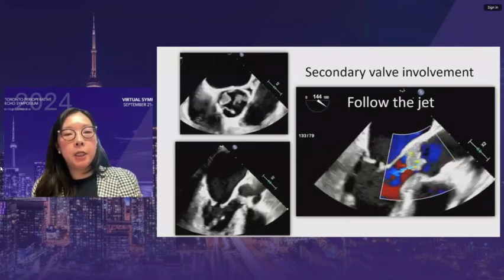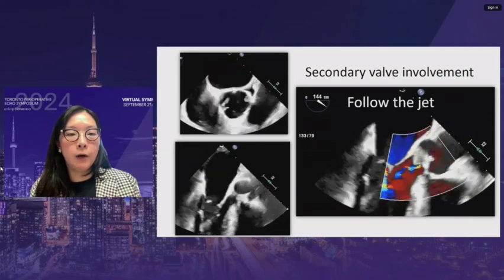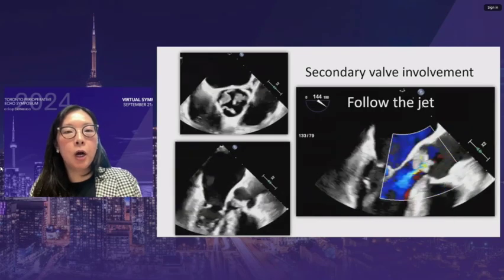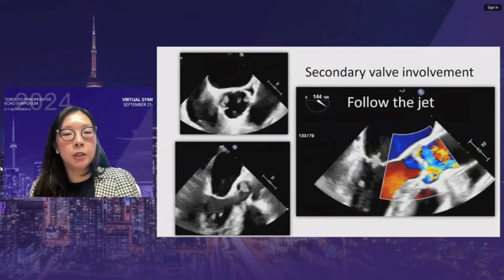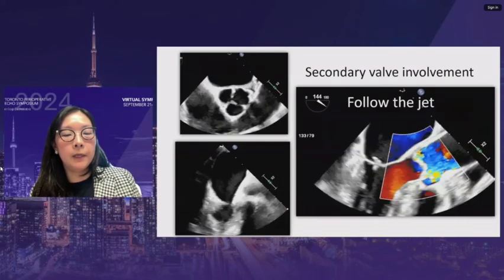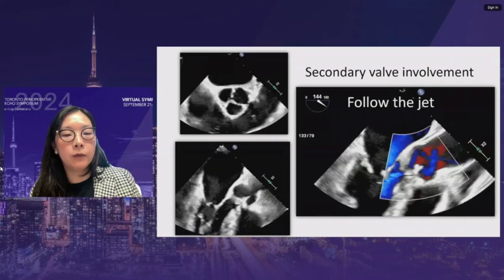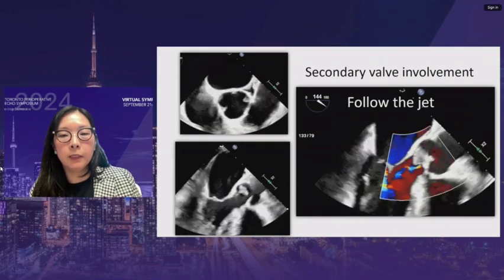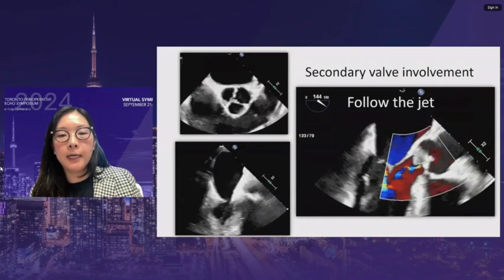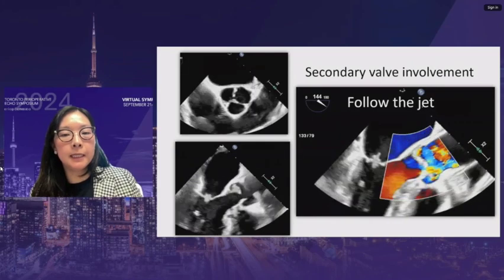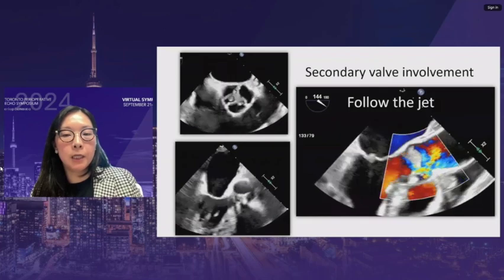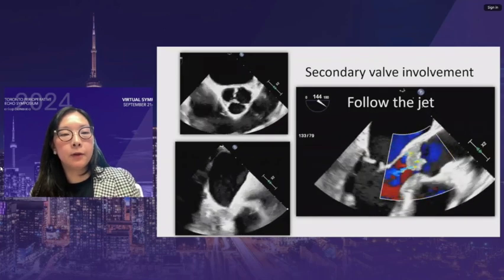Whenever a vegetation is found on one valve, all other valves must be examined. Vegetations can spread via jet direction. Multiple vegetations are seen on both the non-coronary and left coronary cusps of the aortic valve, and vegetations on both the anterior and posterior mitral valve leaflets. Color Doppler over the aortic valve shows the jet coming down and hitting the anterior mitral valve leaflet — this is how the mitral valve leaflet was seeded. When a large vegetation is identified, always follow the jet direction and examine the downstream area for secondary vegetations.